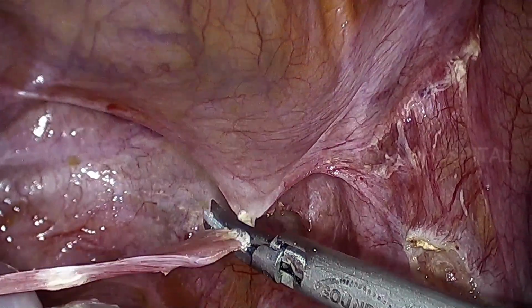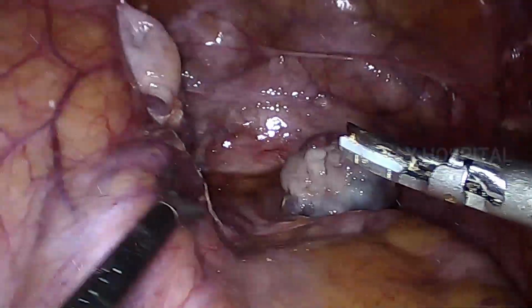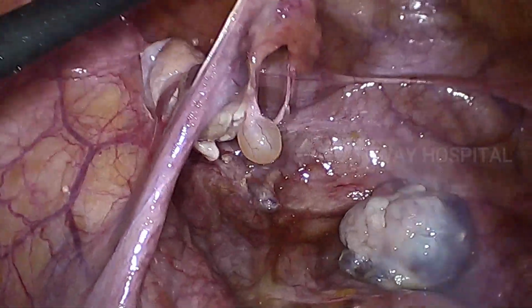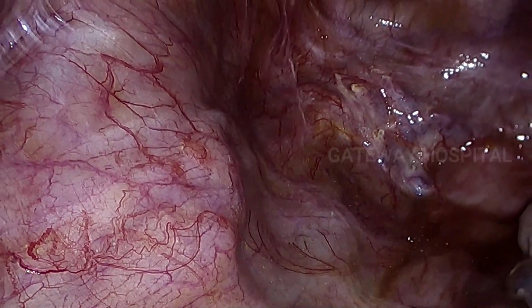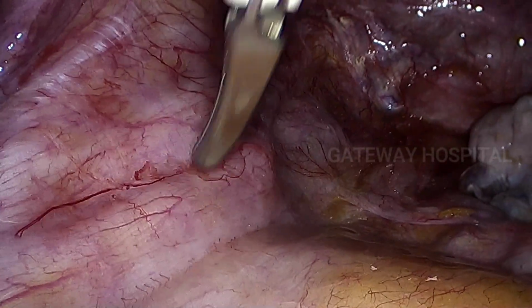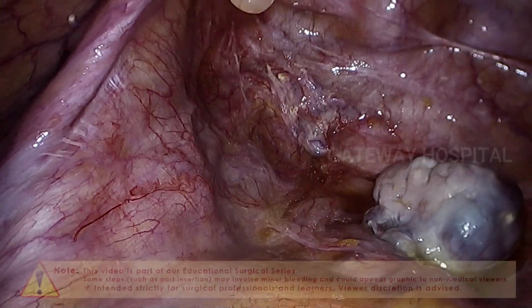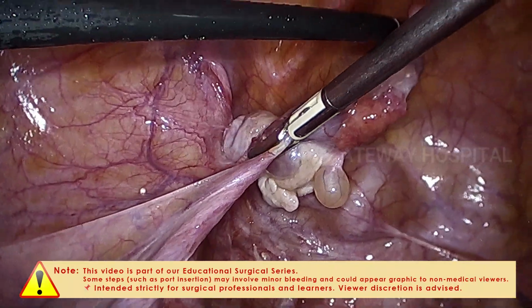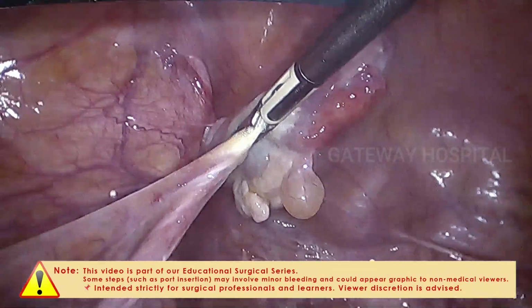Similarly, we are lifting the left side tube and ovary, and we are inspecting the course of the left ureter, that is the left ureter which we are seeing. And now again the same step is repeated. Use a vessel sealer device. If you do not have a vessel sealing device, you can use a bipolar and seal.